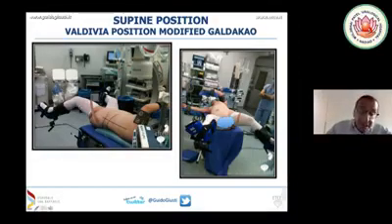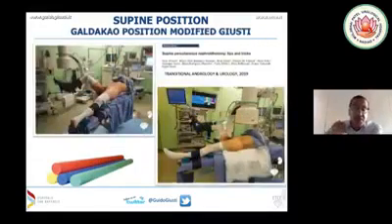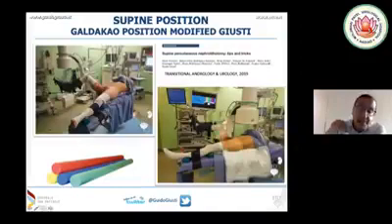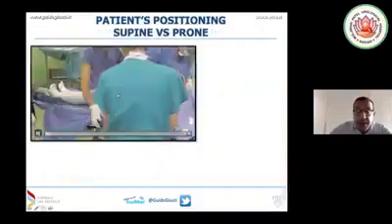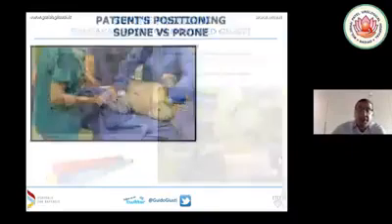Because in the beginning, sometimes I had a problem of conflict of my rigid nephroscope against this metallic support. That's why we changed, and actually this is our position. You see, we keep half of the operating bed on the stone side and the stirrup only on the contralateral side. So if I have to do this movement to reach the upper calyx, it is very easy and there is no conflict anymore with the operating bed.